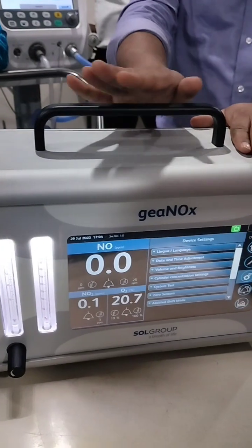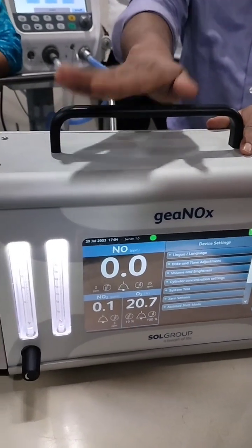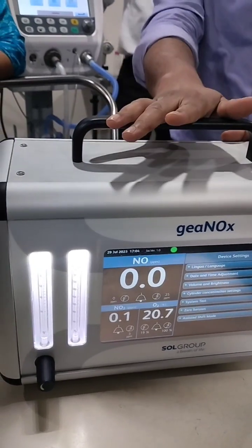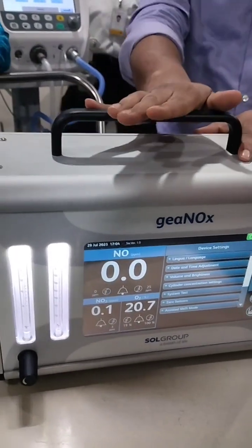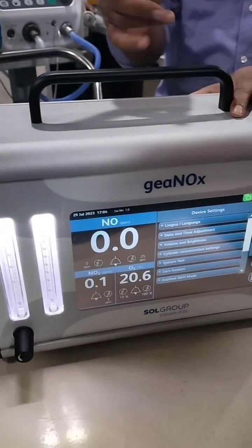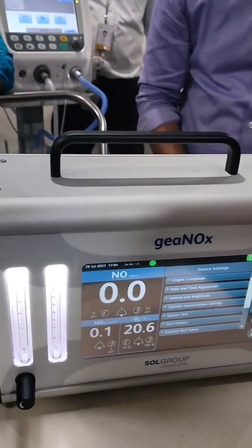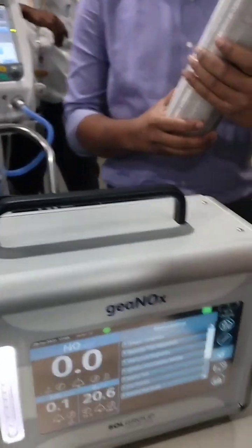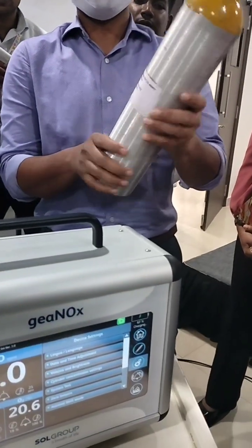This device has to be calibrated every day when you are using therapy, and every 28 days a detailed calibration is done. The daily zero sensor calibration is self-explanatory. For the 28-day calibration, the biomedical team will come and calibrate using these two cylinders — this is the NO cylinder used for that purpose.